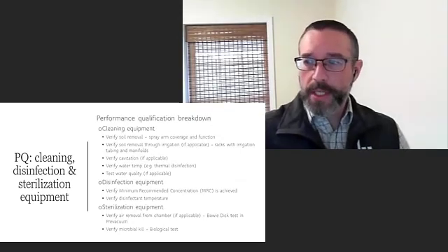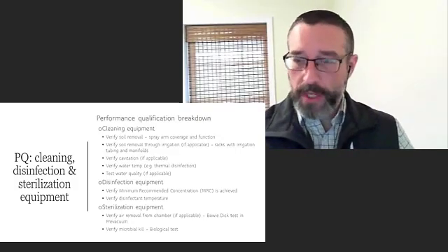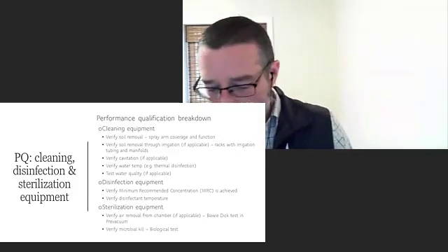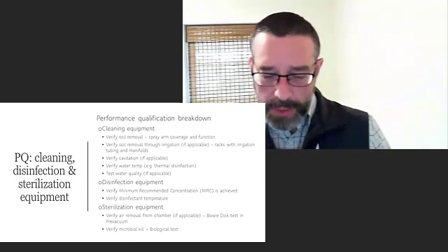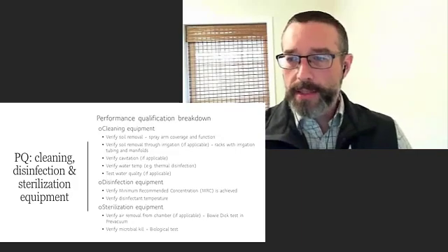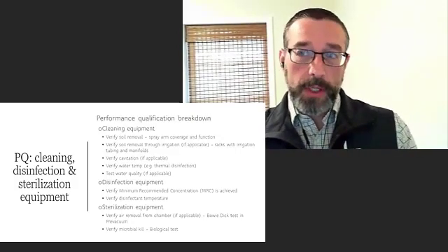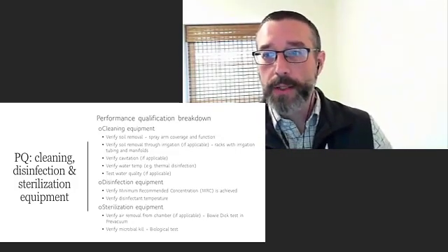And then, of course, our sterilization equipment needs to be running in the way that it normally does, which is pre-vacuum sterilizers have to run your Bowie Dick, and then your biological testing. I just want to look at a few things that help you do that. If I'm trying to verify soil removal, then an object with a test soil, trying to clean blood off of stainless steel, is what we expect our washers to do, and running a test that can actually perform that is a good idea to make sure. And this would be, if you're going to especially come back to full strength, we're talking about every washer and every washer rack we need to know that it is ready to go.